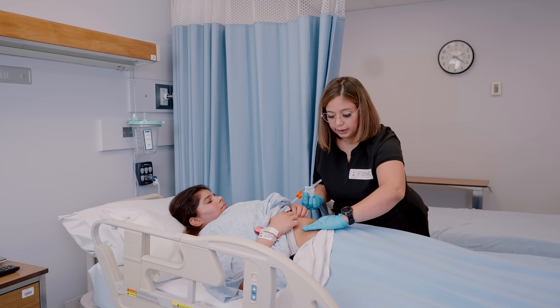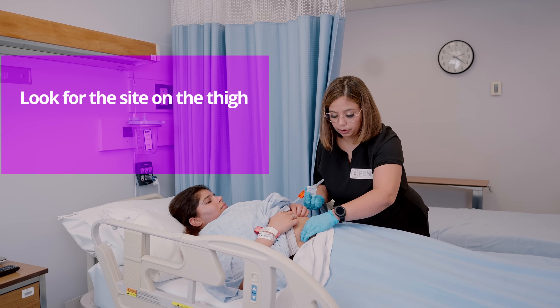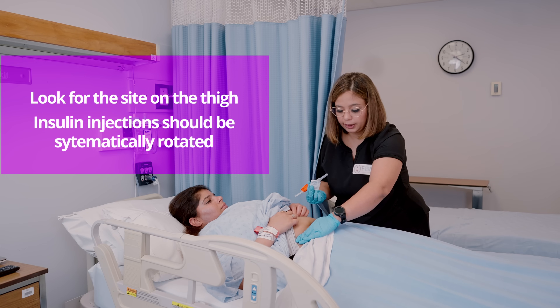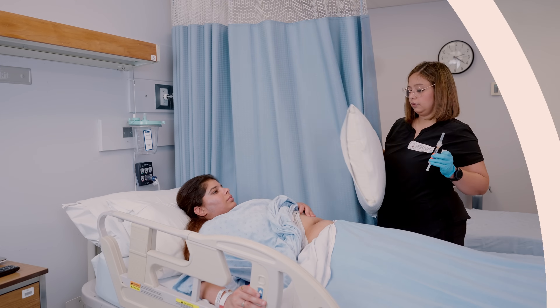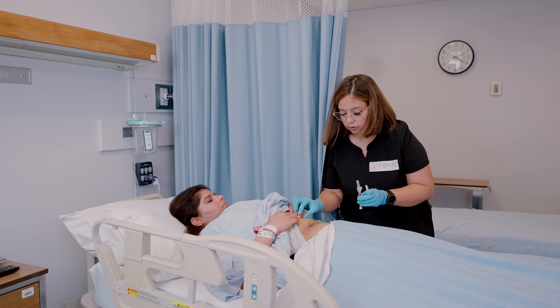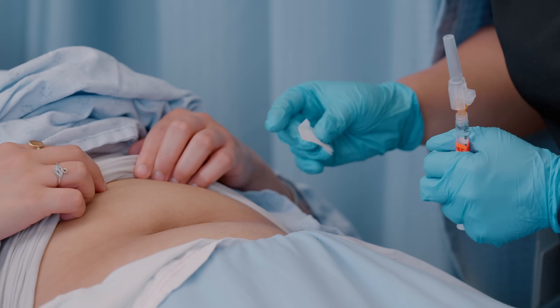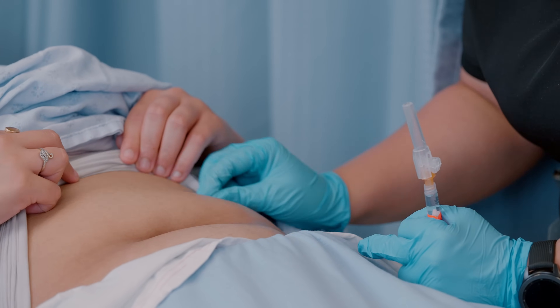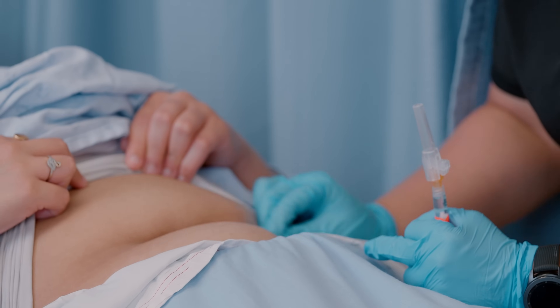If the abdominal area is not available, look for a site on the thigh. Insulin injections should be systematically rotated within one anatomical region, either the abdomen or thigh. Help the patient find a comfortable position and ask him or her to relax. Perform hand hygiene, apply clean gloves, and clean the site with an antiseptic swab in a zigzag manner for a minimum of 30 seconds.